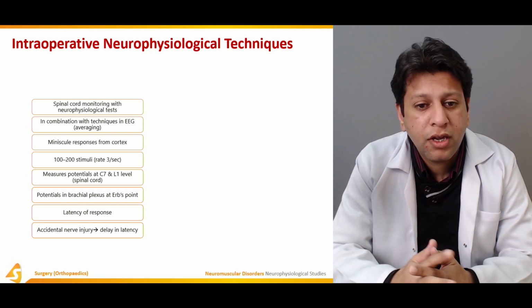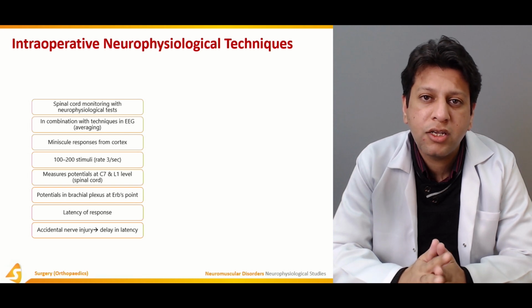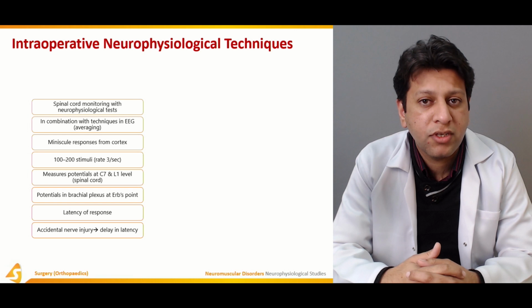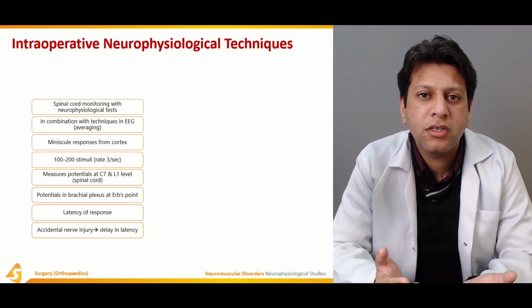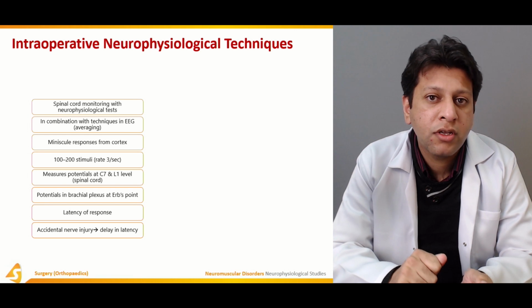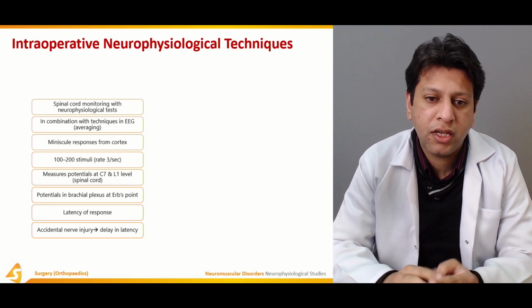But now it has shifted to intraoperative neuromonitoring techniques, which are computer based and use electromyography electrodes to monitor whether there is an action potential or not, which is being generated in the muscle. If this is not generated, then it has probably resulted in some kind of neurological loss. Therefore, before doing the final fixation, they decrease the curve, so there's minimum stretch on the nerves at that time.